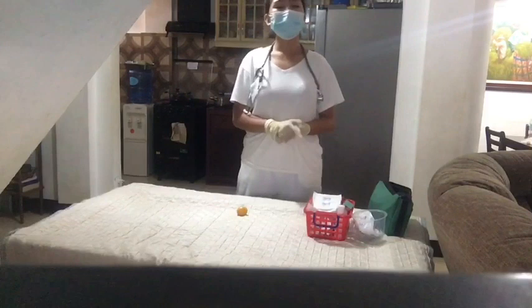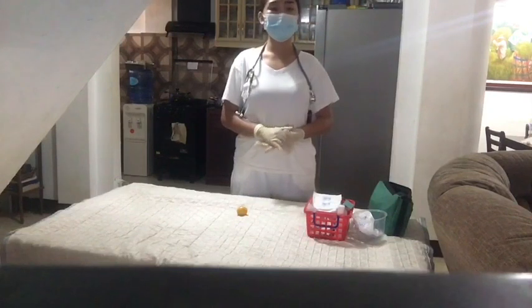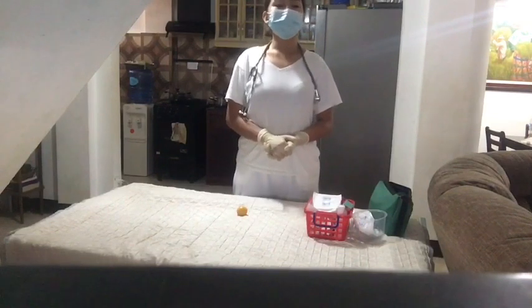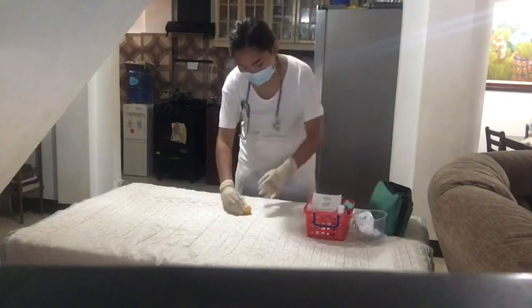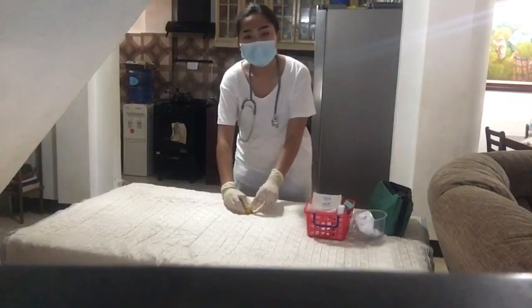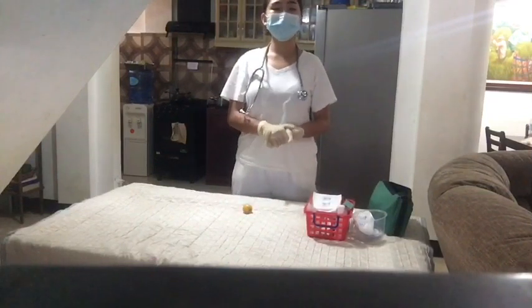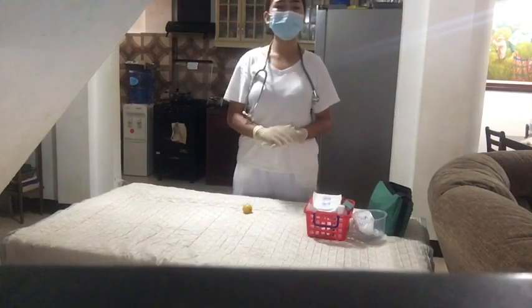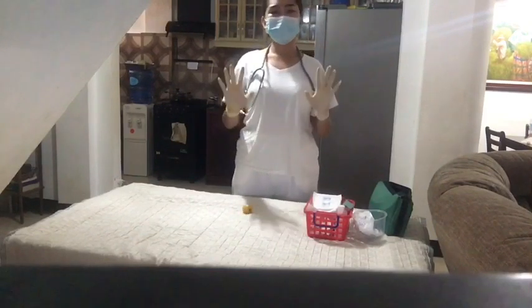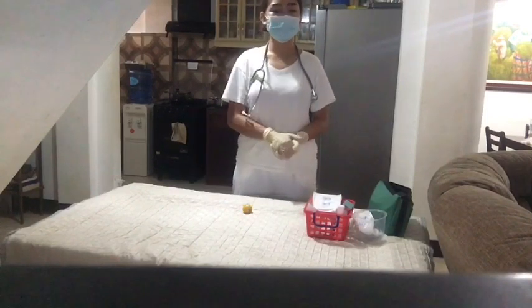So the next step is to select a site free of tenderness, swelling, scarring, itching, burning, or localized inflammation, and one that has not been frequently used, because lumps may indicate a previous injection site where absorption was inadequate. So after selecting a site, put on a clean glove. I am done putting on my clean gloves because I am done washing my hands. This promotes safety from any pathogens.